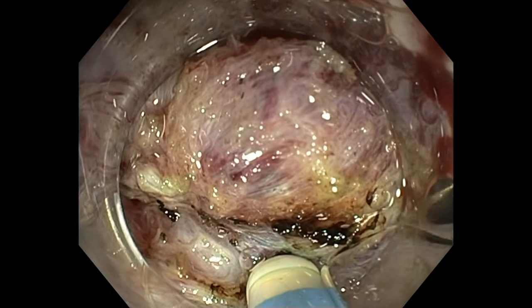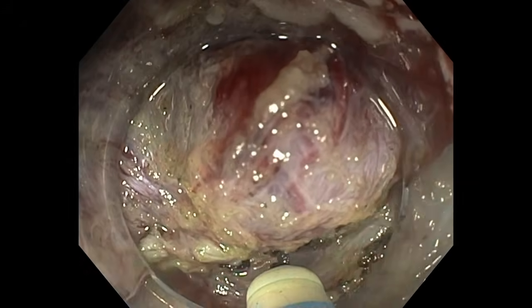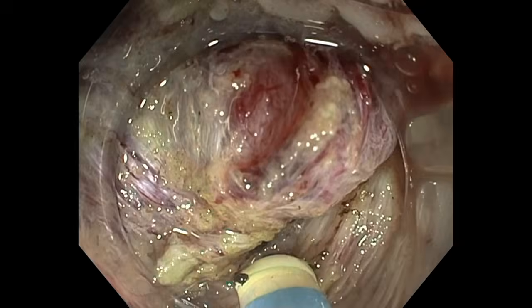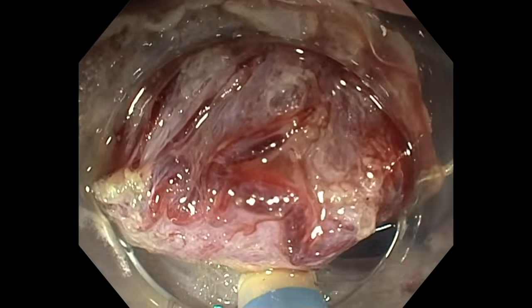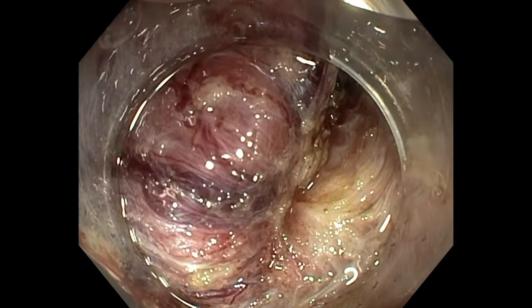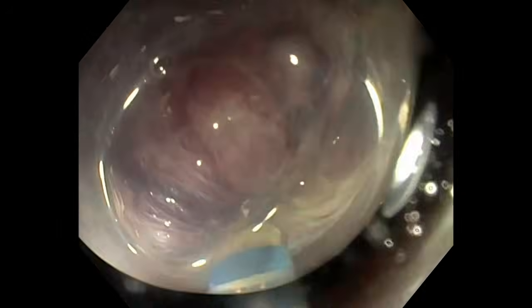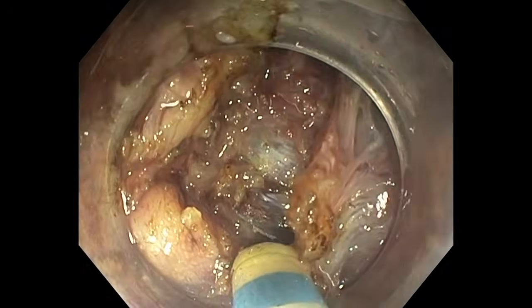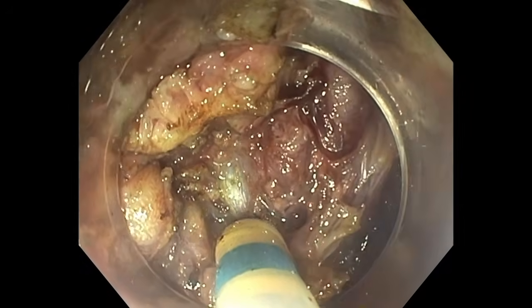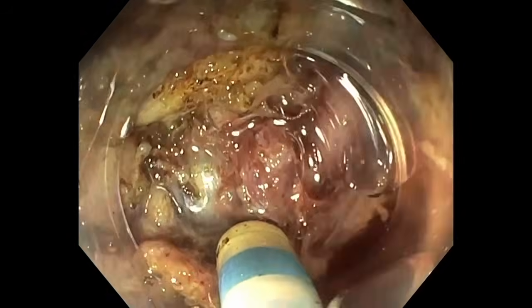We will damage the muscle because it's difficult to do differently and to avoid any muscular contact, but at the end we will be able to cut muscles in the center, but a relatively small area of muscle will be damaged, and we will close it immediately after. So you can see here that it is muscle in the middle. I prefer to finally go to the muscle and not to the lesion, even if I damage the muscle, because my goal is to be R0 at the end.